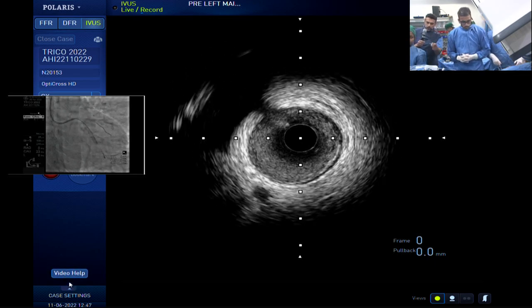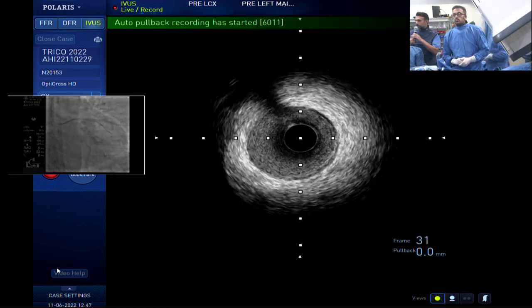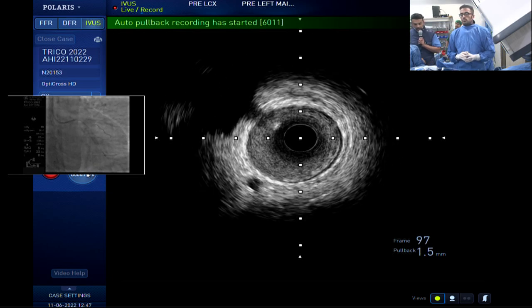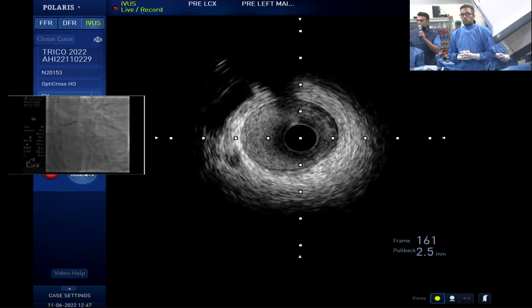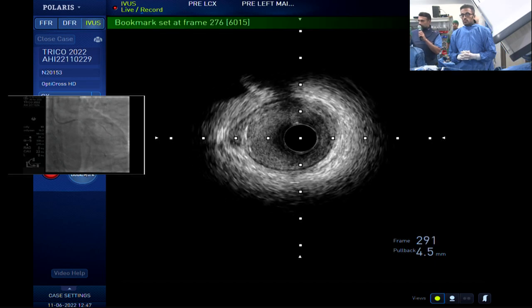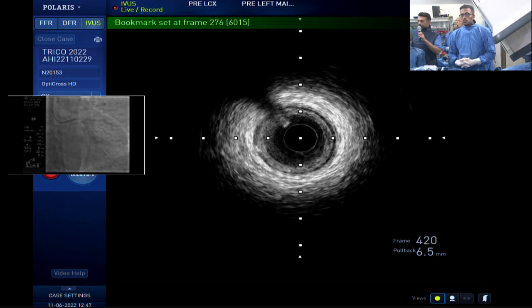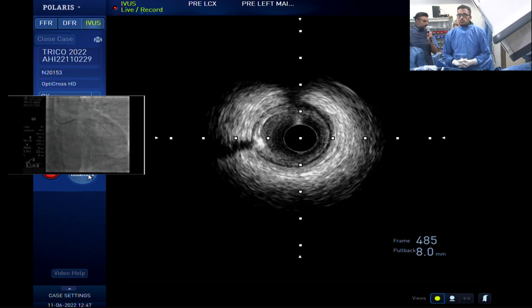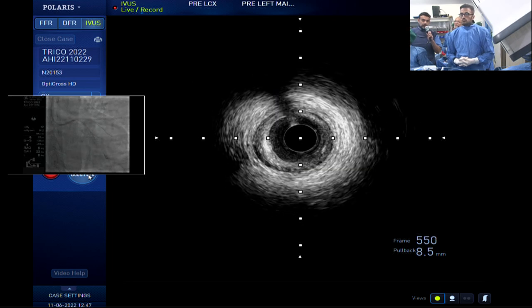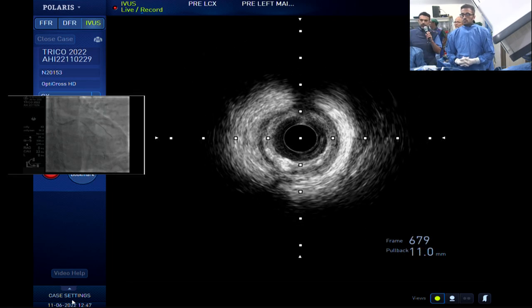So now let's go auto pull back. So just press pull back here. Okay, and now let's watch this and get ready to cine again. So it's now pulling back. You're not seeing a lot of back and forth because the guide's very well engaged. And you know you've got lots of safety room on the distal edge there, right? Right, there's plenty of safety that you have in terms of length. Yeah, that's right. Right, which is fine. You know, typically with zero contrast PCI, you take a slightly longer stent than necessary, right?